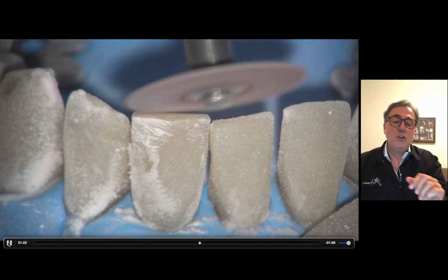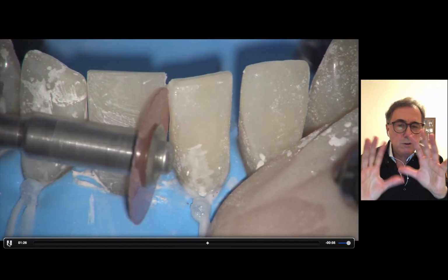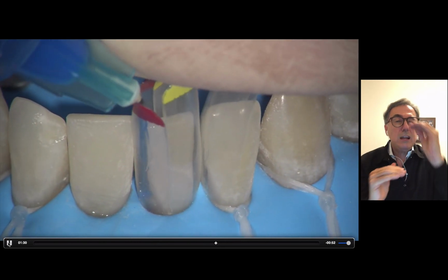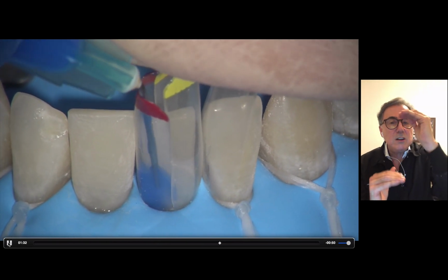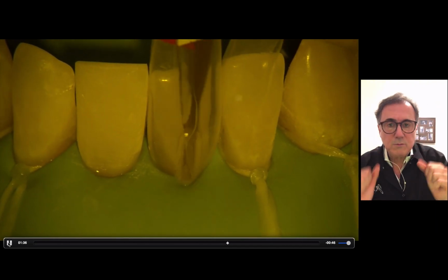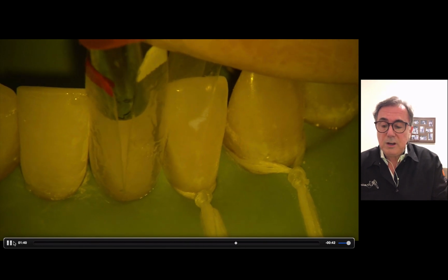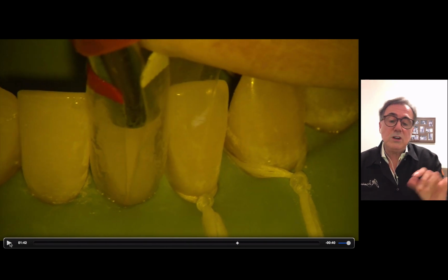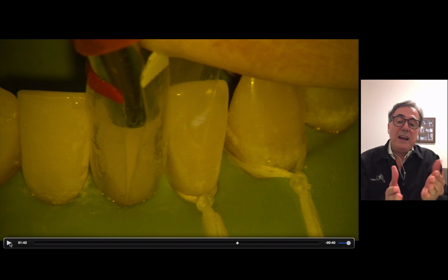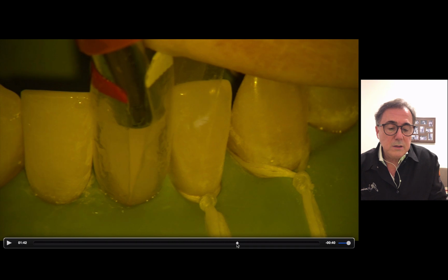So we're going to do a simple primary anatomy, very simple anatomy. Just make sure you have the proper width and a little bit more height of the tooth, so that, as I said before, you can check the occlusion later. So then afterwards, let me stop here a little bit. We're going to place the matrix in the neighboring tooth, and I'm going to come back here just a little bit.